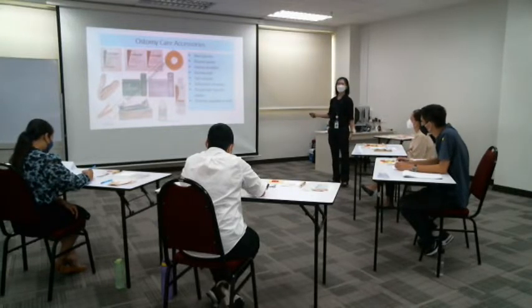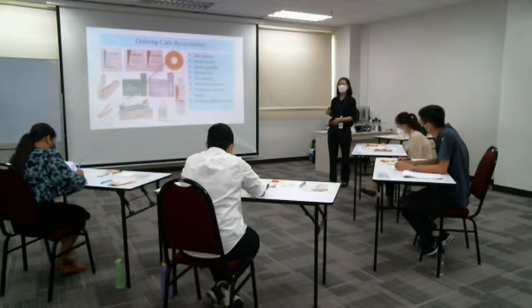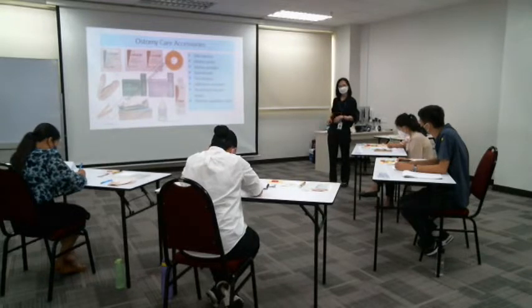Stoma powder. The powder is put onto the skin excoriation part, to help to make it drier and also to have some antiseptic effect. Tail closure. This is tail closure.